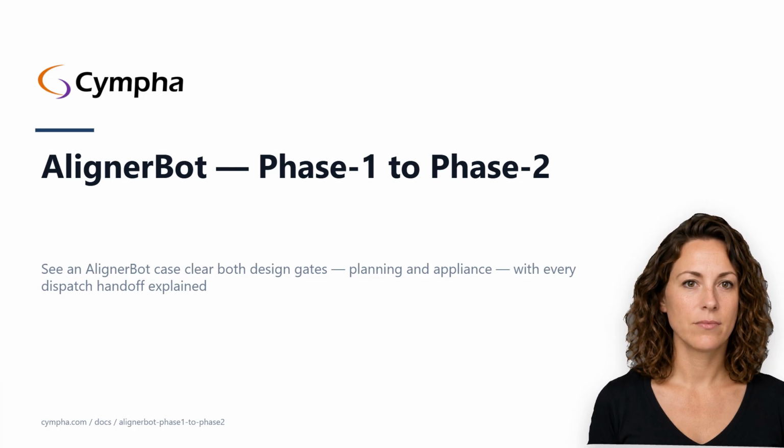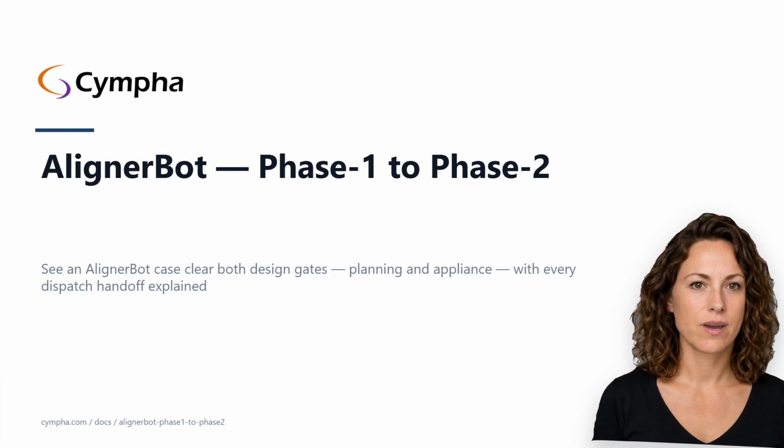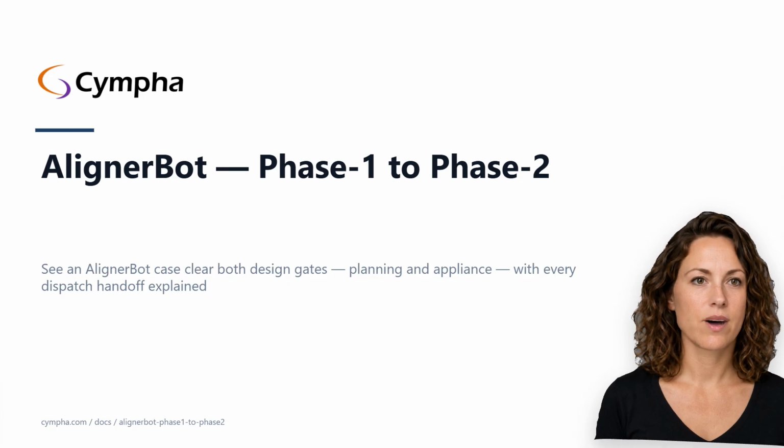This lecture is for all three people in the loop: the clinician who submits the case, the lab manager who routes it, and the AlignerBot operator at the lab whose workstation does the designing. Watch it end to end, so each role knows what the other two are doing.